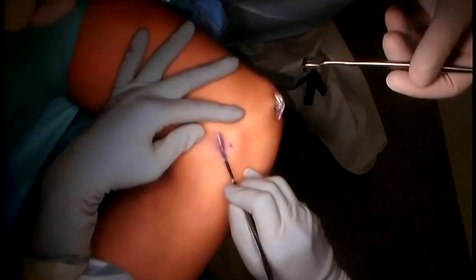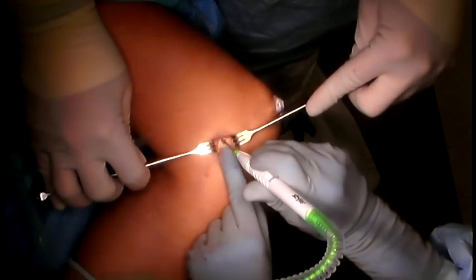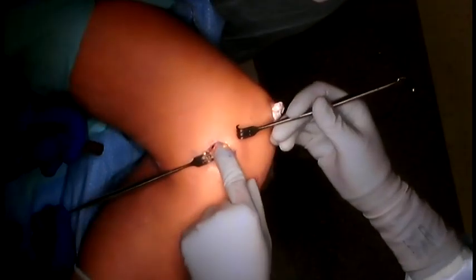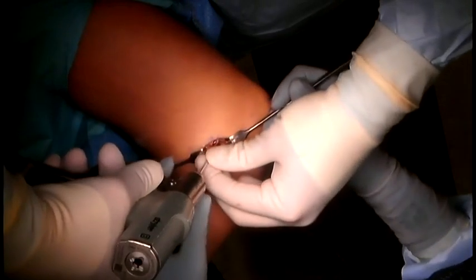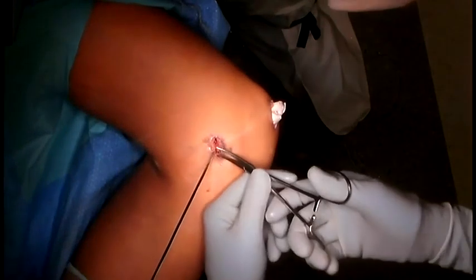Attention is then directed to the medial femur, and a 1-inch incision is made between the medial epicondyle and adductor tubercle. The bony depression is palpated between the two structures, and a guide pin is placed in this location. The position of the guide pin is confirmed using fluoroscopy to be posterior to Schottle's point.